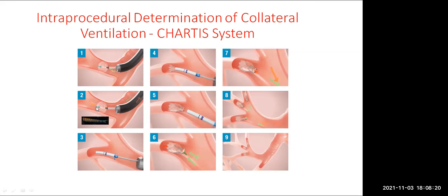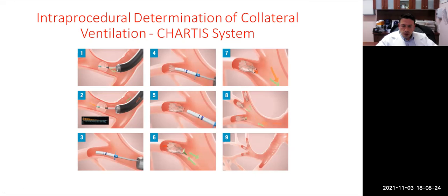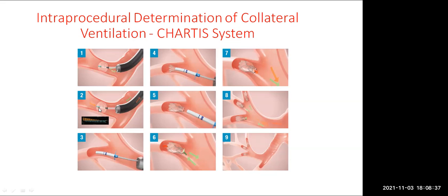Anyway, I'm really curious as to exactly how that works. My understanding is that the thermistor is located right over here by where the green tip is. I agree, that's what it's looking at. That's just measuring a temperature change, and it could be measuring it because gas is flowing over it.